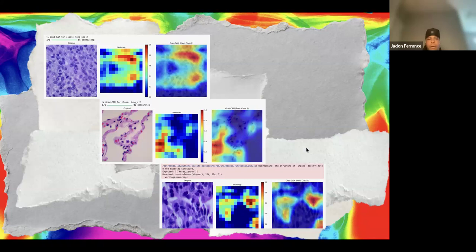So that would be something I would have to test, but I would think it is possible to be transferable amongst different cancer types, as long as it's able to be viewed on a tissue level. Yes, it's really about the tissue, right? Right. It's about the changes in color. This is what you're doing.